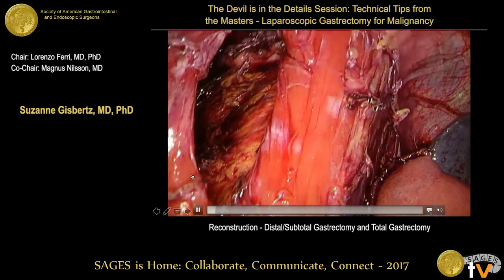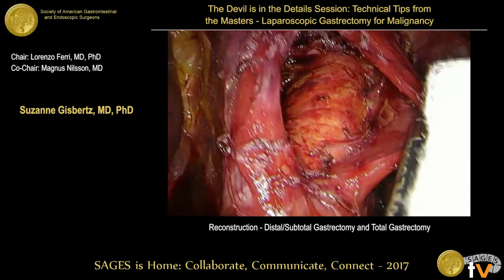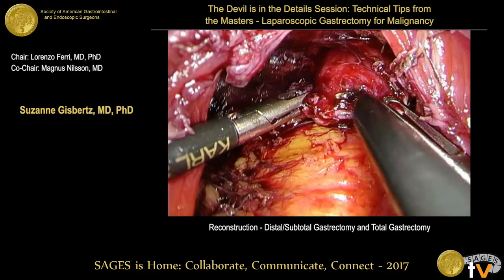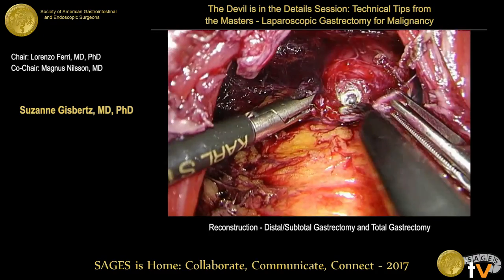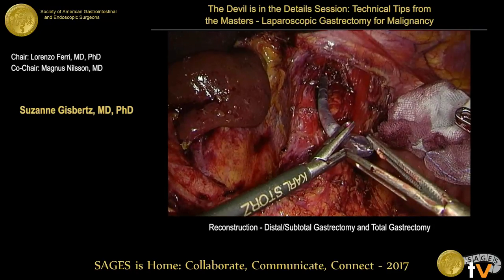With distal esophageal resection, you can see the plane over the aorta. Again, the OrVil is inserted through the mouth by the anesthetist, and the esophagus is opened using diathermy.